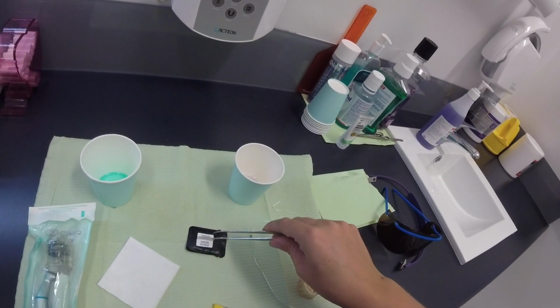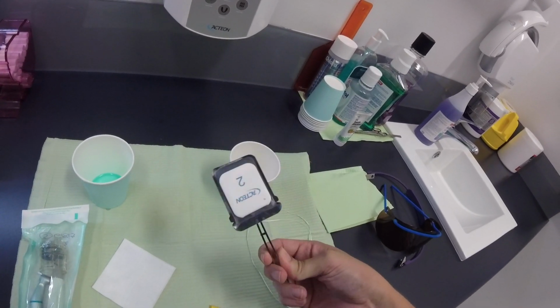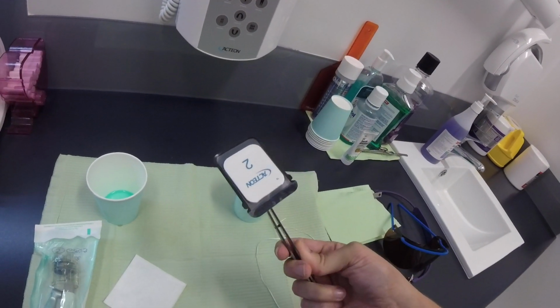So these are usually on a roll. You just pull one off. They come in sets of two. They usually take 2 bite wings in a procedure. I've just got one out for a demonstration.